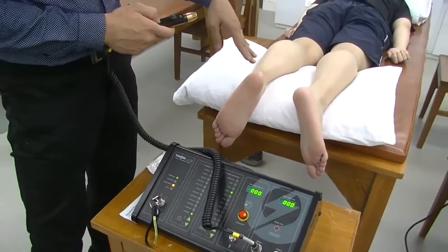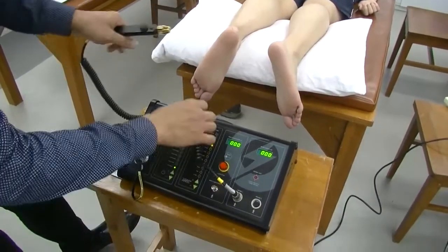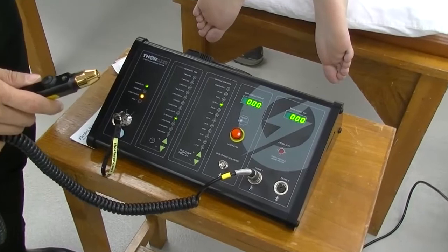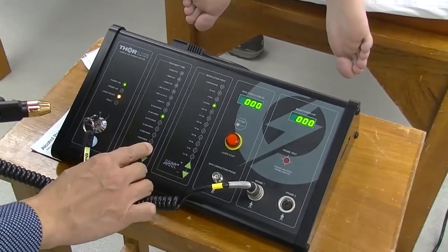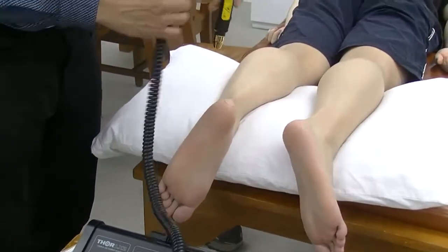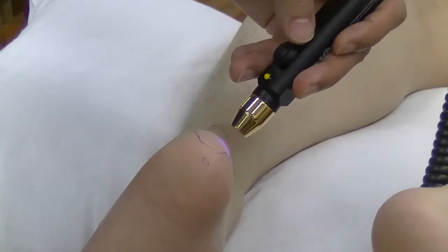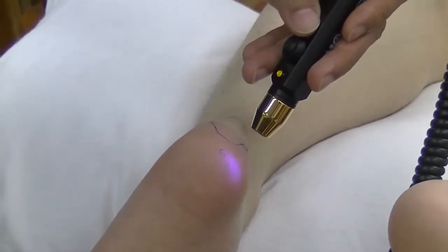Now we perform the non-contact method directly over the wound, holding the probe approximately 1 centimeter above the wound bed. Before starting, we reset the time. The wound area is 4 cm squared, and given a dose of 1.5 joules per cm squared, the total energy needed is 6 joules. With a power output of 0.2 watts, we require 30 seconds to complete the treatment. We press the button and begin moving the probe evenly across the entire wound region.